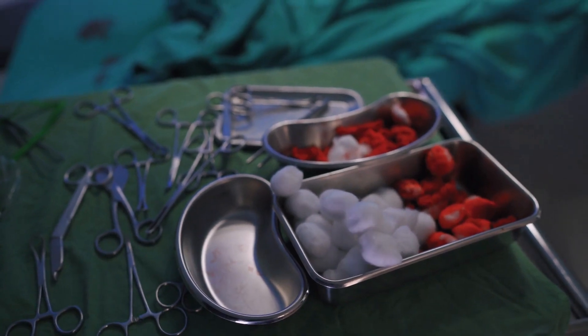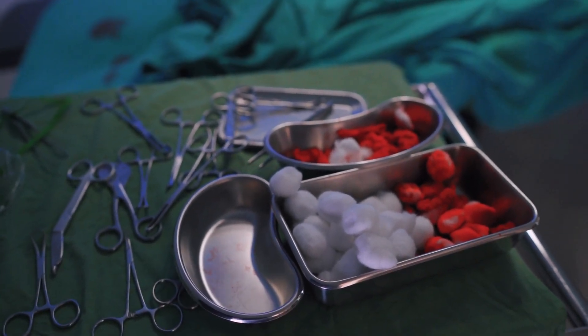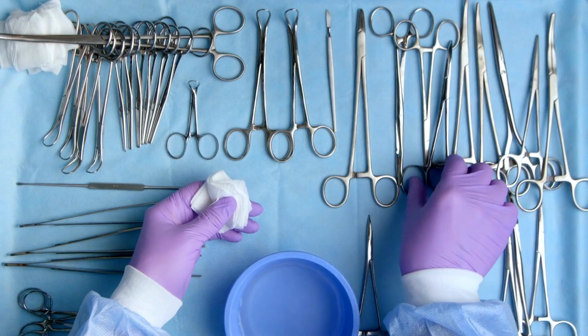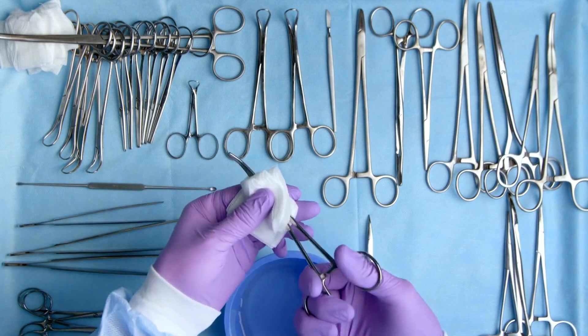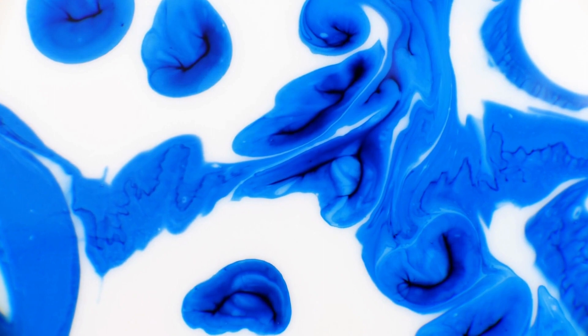Picture this: surgical instruments riddled with tough-to-remove debris and stubborn microorganisms. Traditional cleaning methods may leave dangerous residue behind. But do not worry — multi-enzyme cleaners are here to revolutionize the game.